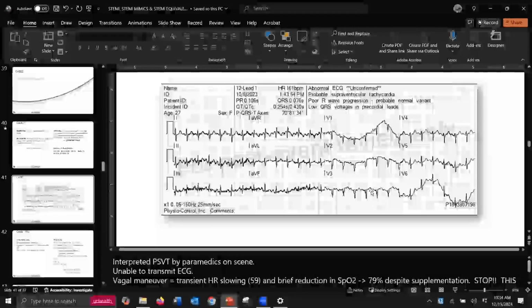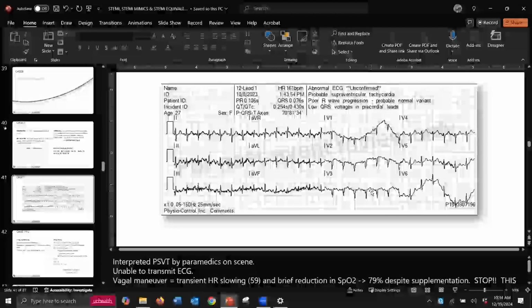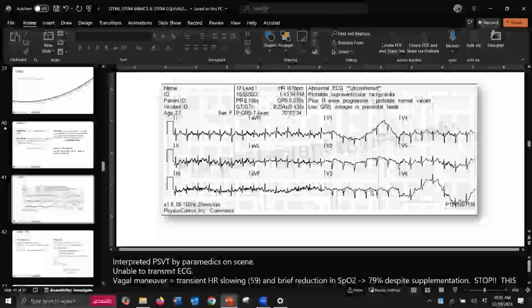Absolutely. Oxygenation, oxygenation. So you put her on oxygen, 15 liters non-rebreather, that gets her up to a magic 85. I know this. Good enough. What are her lung sounds? Lung sounds are essentially clear. Well, since it's the EKG class, I feel like it's not predominantly pulmonary related. It's been doing that the whole time. Oh, has it? I just noticed it. We just wait till it comes back up. That's cool.